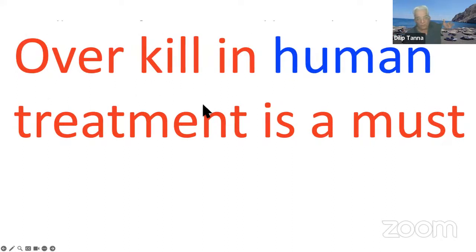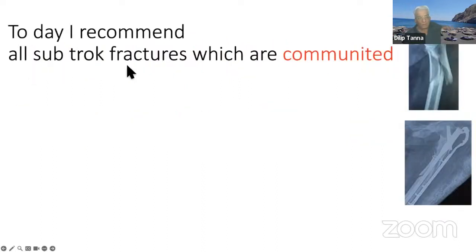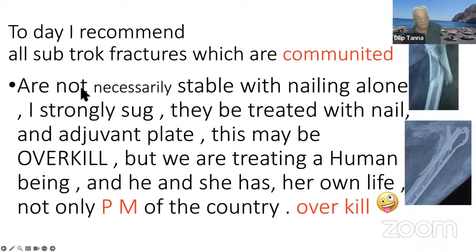I come to this situation. On day one when I operate, everything which you think is needed has to be done. Today, I recommend this for all subtrochanteric fractures which are comminuted. Please mark the word comminuted. If I tried to put in a nail, it wasn't very stable. So I put on day one a hook plate. They are not necessarily stable with nailing alone. I strongly suggest they be treated with nail and adjuvant plate.